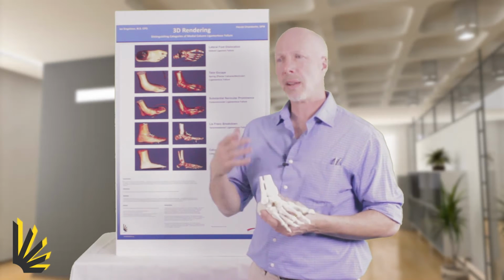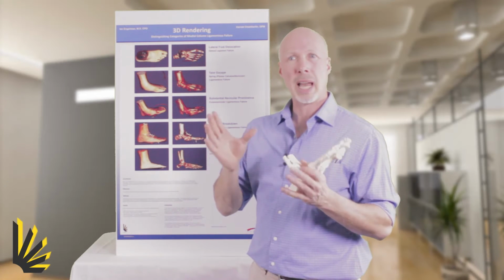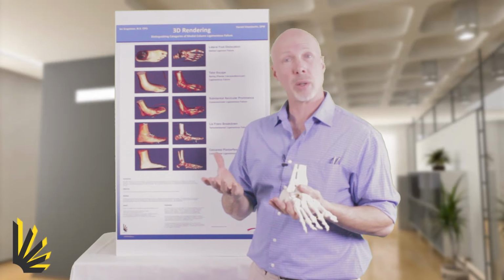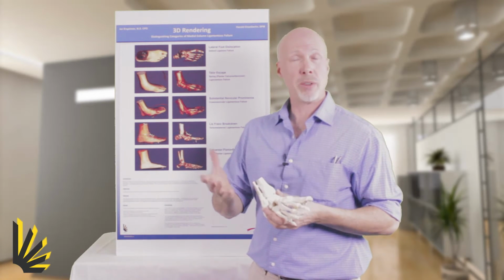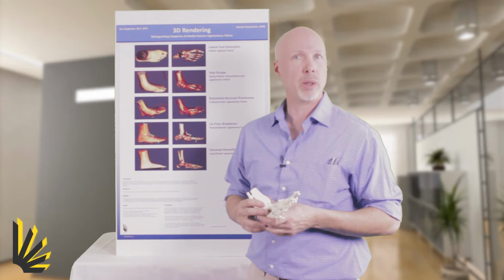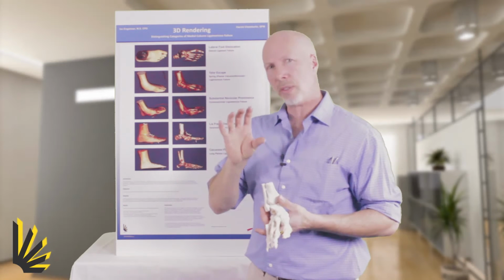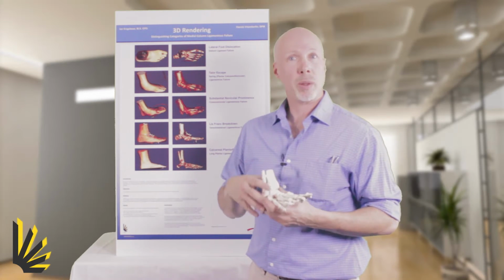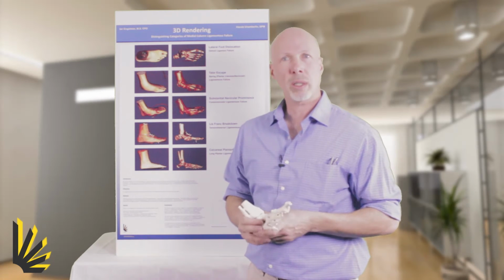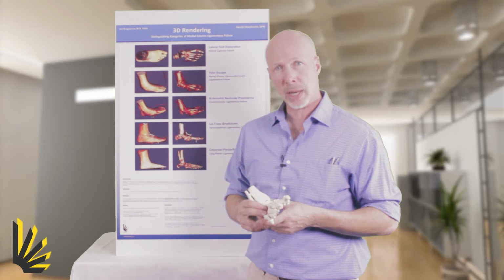But what we found at Insightful Products is none of those definitions really give us a complete picture of what's going on. And after seeing thousands of feet, we noticed, hey, there are different categories and we can distinguish the different categories. And especially using this new tool, 3D rendering, we can better understand what it is we're dealing with. And if we have a better understanding, or we've distinguished it a little bit better, then of course we can manage it equally better with our braces. So that's what we're here to share with you now.